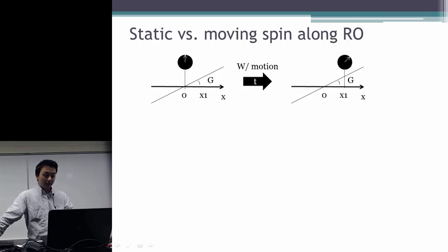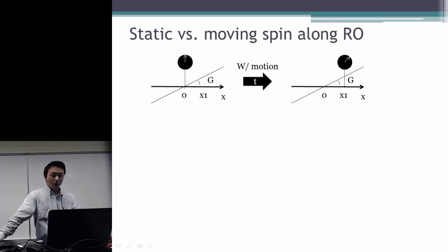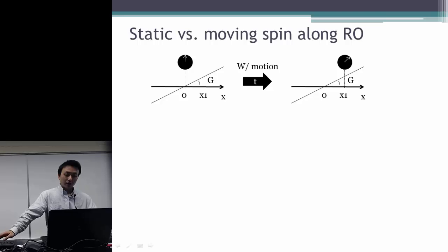But when there is a motion related to those tissues, such as the blood, or sometimes the cardiac beating, or when you are breathing, your chest is moving. So these constitute the motion scenarios that we have to deal with in MRI. So we have to understand what a moving spin would look like in an image, and what is the effect of the motion in acquiring an MRI signal.